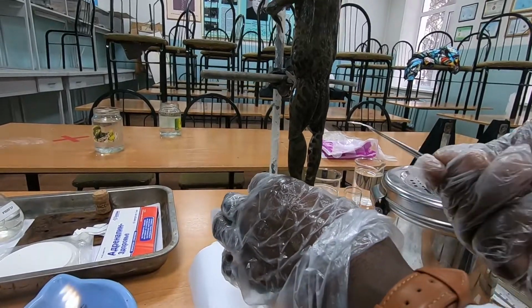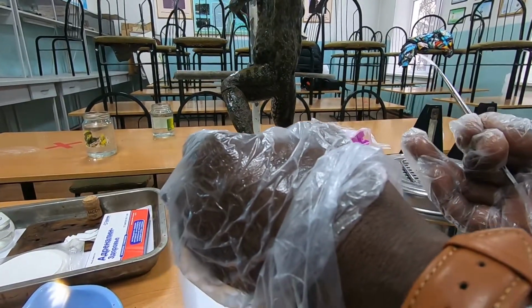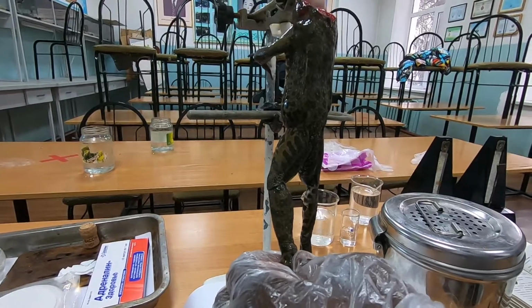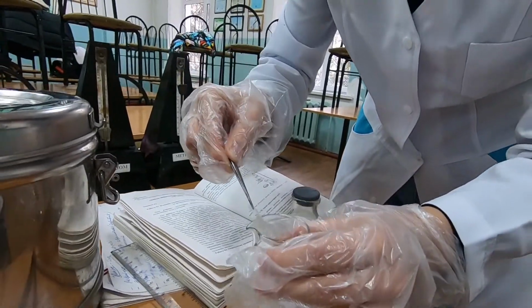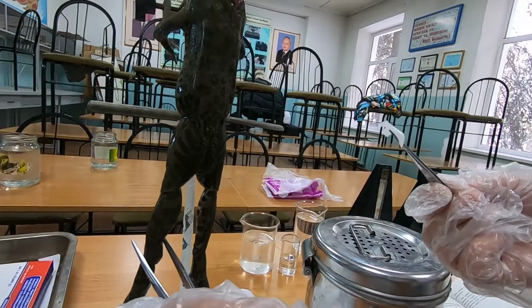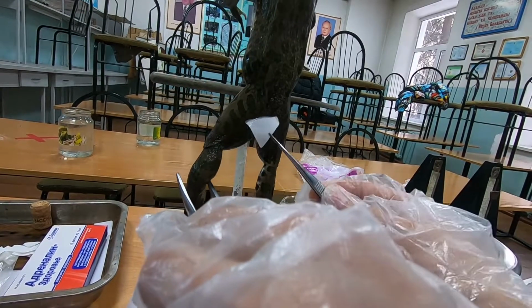You're going to see what will happen. We're going to put it in between the legs. Understand? So you're going to put it in between the legs. No, not there. In between.